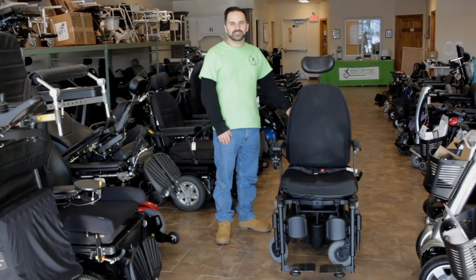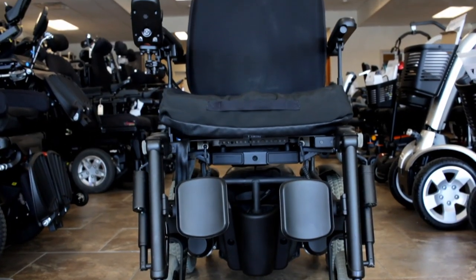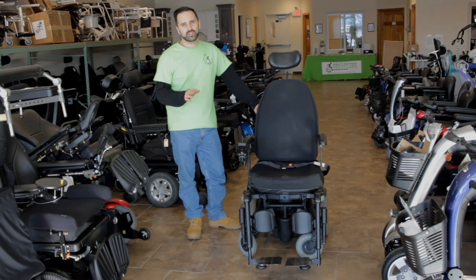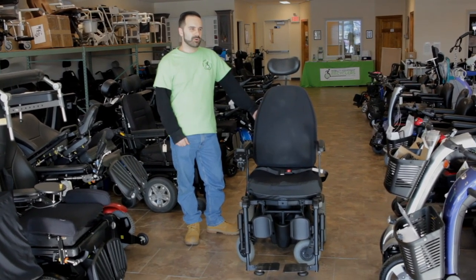Hey guys, how you doing today? It's Andrew Solani, and I have here a Quantum R4000 power wheelchair. This chair has very high torque motors. Depending on which kind you get, they can go anywhere between six miles per hour to eight miles per hour.